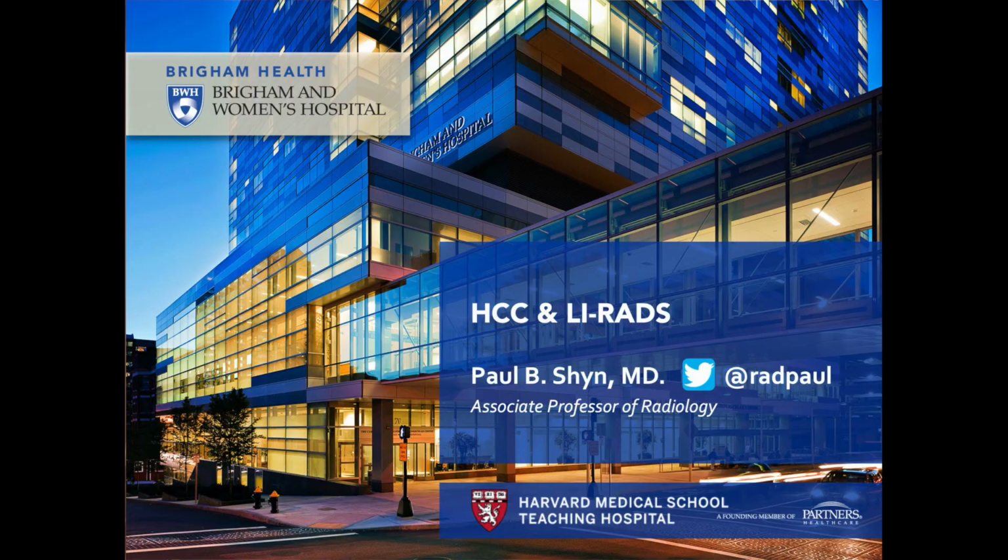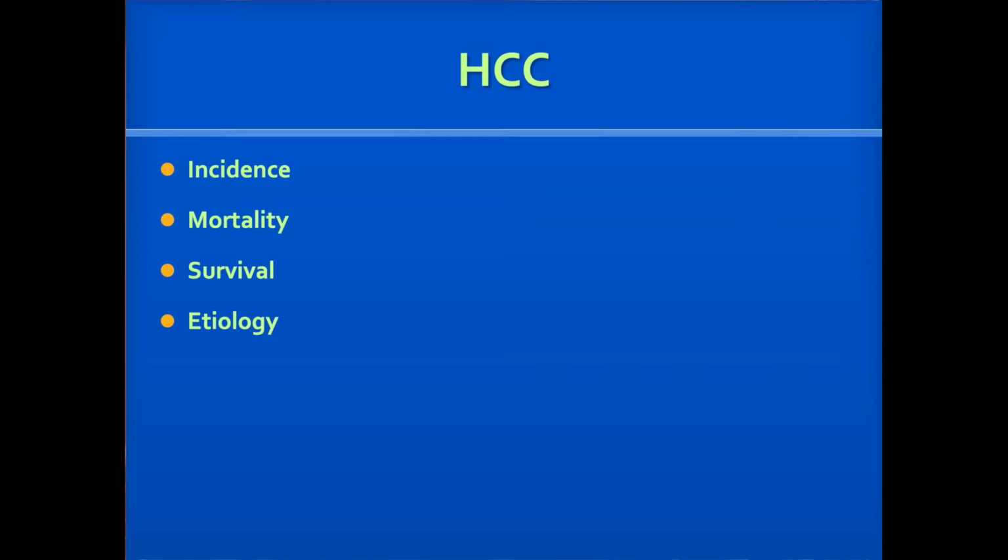I'm Dr. Paul Shyn. The topic today is imaging of hepatocellular carcinoma, and in particular using LI-RADS for HCC. The incidence of hepatocellular carcinoma worldwide places it at about number 6 in terms of frequency. Mortality rate is high though, and so HCC is the number 2 cause of cancer death worldwide.